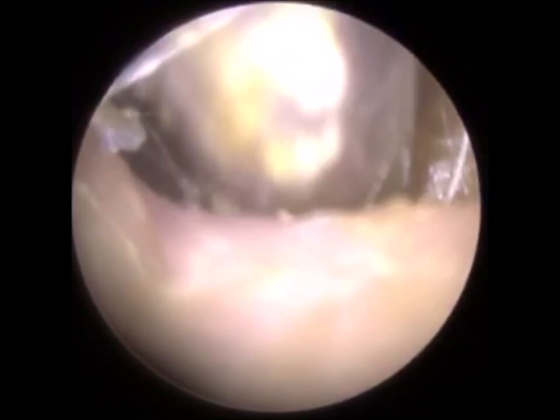But you'll be surprised to learn that once I've got this out, there is another big plug of wax, I believe, or not wax, dead skin. You can see how white this is. It's all fresh keratin, and I'm just using a suction probe, just trying to loosen the ends off, wriggling it forwards. Remember, this plug of skin is much, much larger, probably 4 or 5 times larger than the client's ear canal entrance.